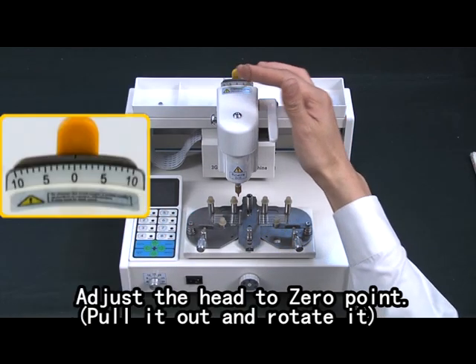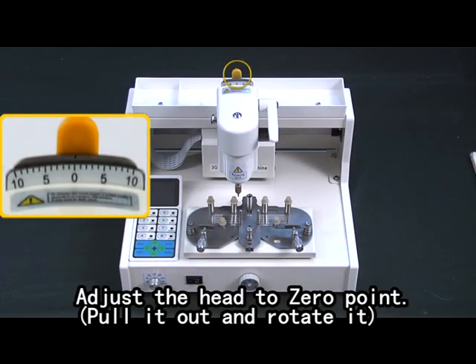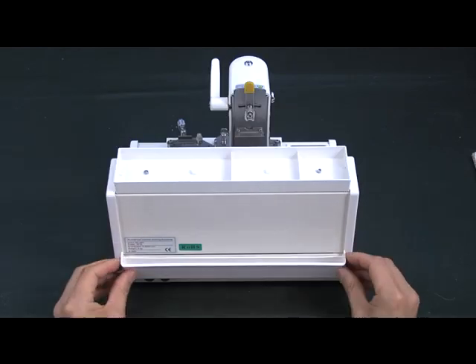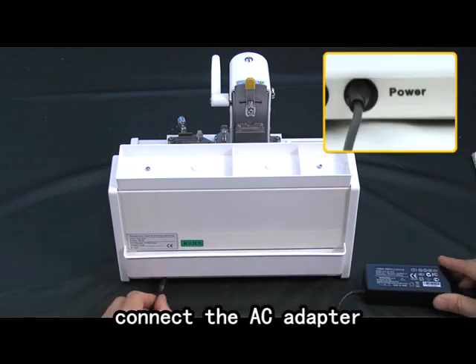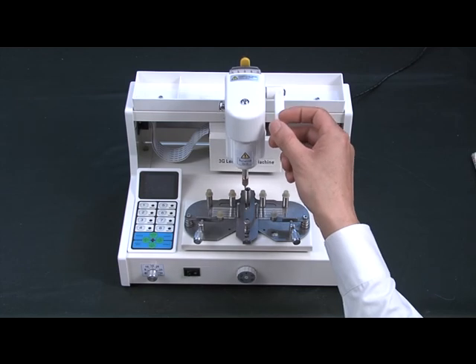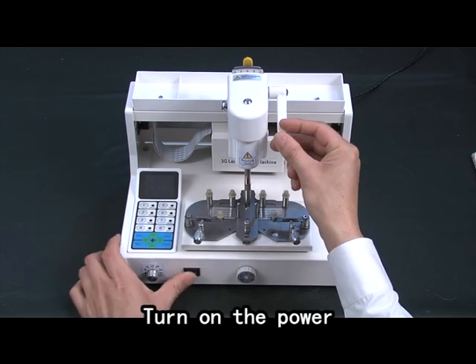Adjust the head to zero point. Pull it out and rotate it. Load the scrap box. Connect the AC adapter. Turn on the power.